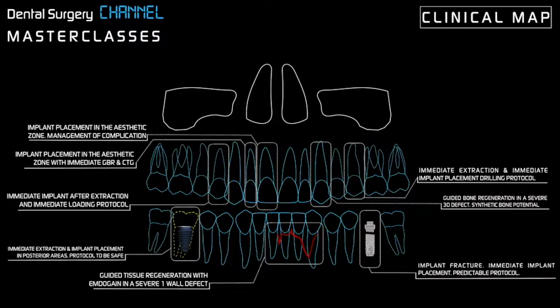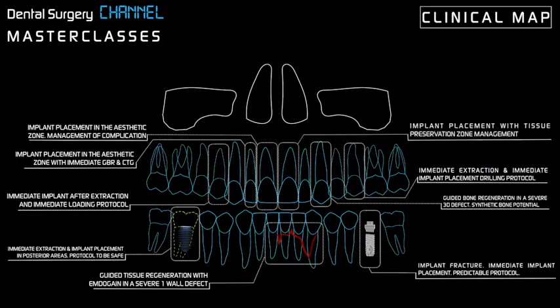One of the most important things is to know how to analyze the socket, analyze the alveolar area where actually the implant is going to be placed and the tooth is going to be removed. There's not too much bone there, but still it's enough to anchor the implant and even make immediate loading. So in this kind of case also, you will also see the drilling protocol that I developed by myself.